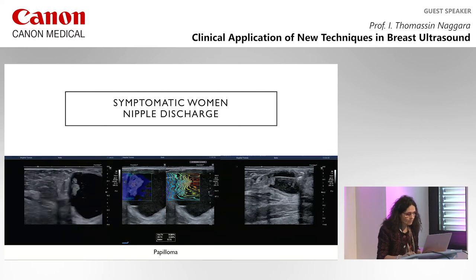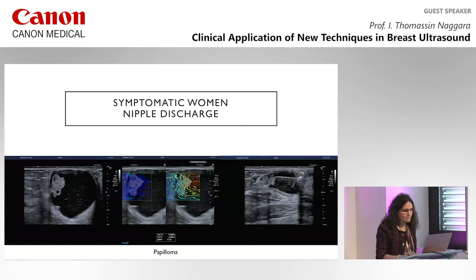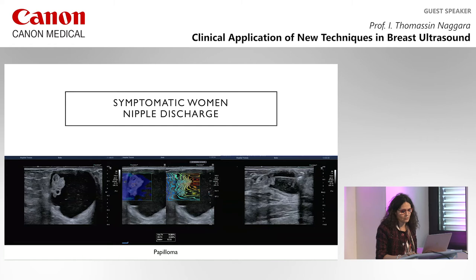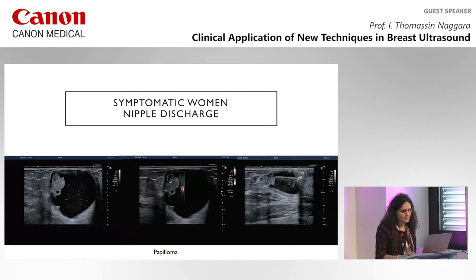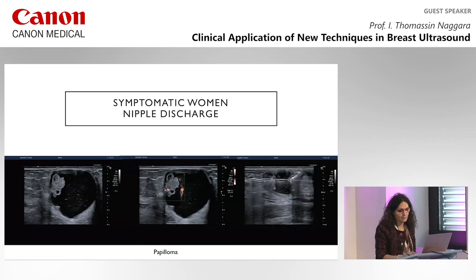Here is an example of a patient referred for nipple discharge, with a cyst showing a papillary projection. Elastography is not so useful for this type of lesion. On SMI there is not much flow inside the lesion, so the first hypothesis was papillary carcinoma, but biopsy confirmed a benign papilloma.